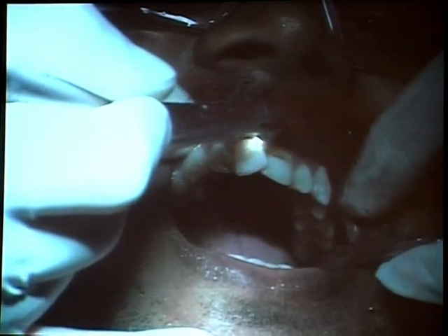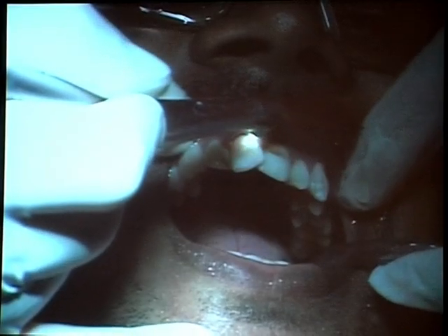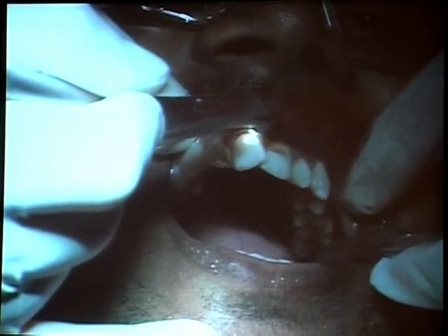Now Ralph is doing the whole prep. You're doing a laminate prep, right, Ralph? Yeah, that's right.